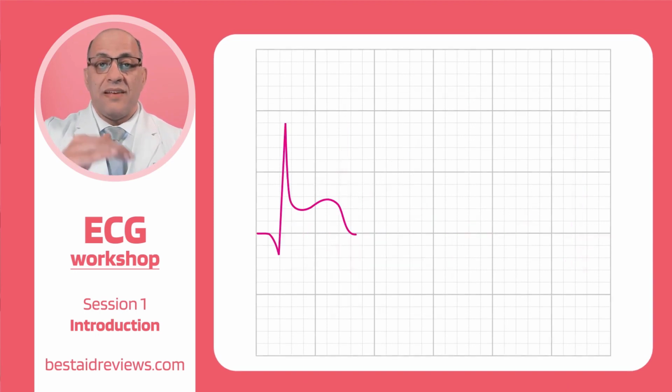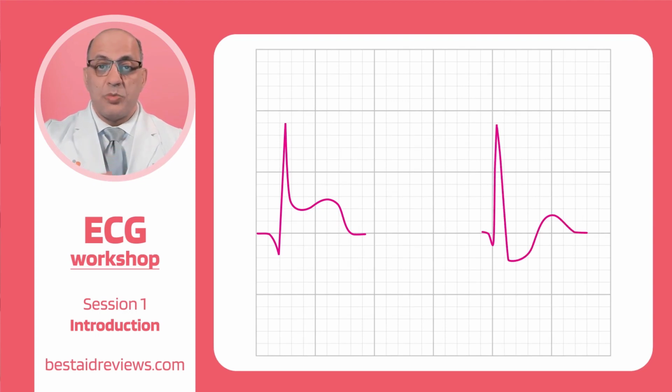Then we look at the ST segment changes. So ST elevation could be a sign of myocardial infarction, and ST depression could be a sign of myocardial ischemia.